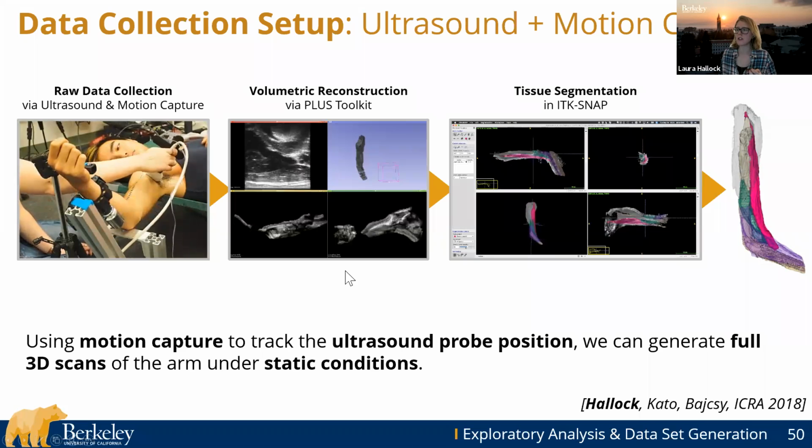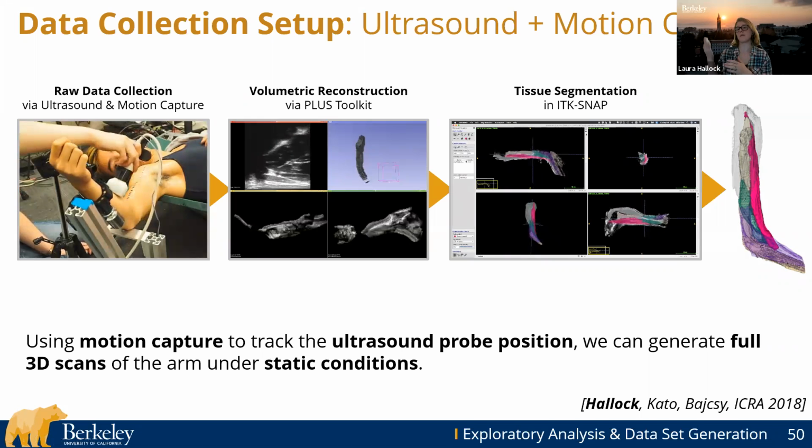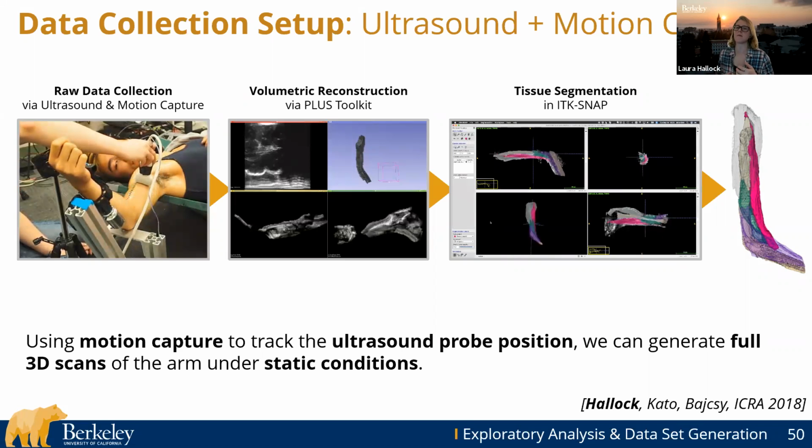and then we performed annotation of those scans for the biceps and the surrounding tissue structures. Note that this time, instead of doing a series of force pulses, because we need them to stay still, we're really restricted to statics. Once we have some insights from these 3-dimensional data sets, we hope to port those over and take a more targeted look at the dynamics.